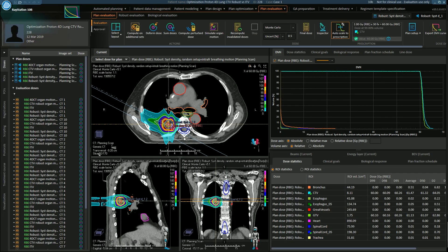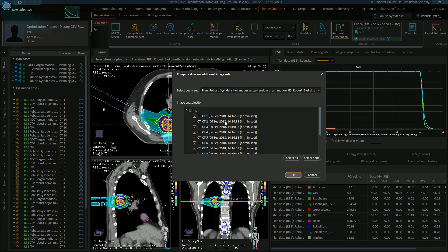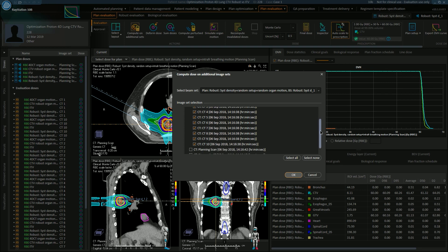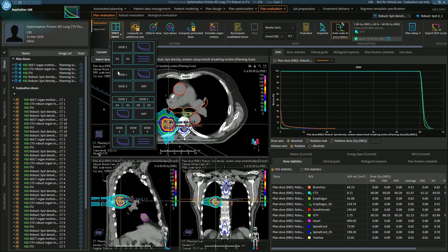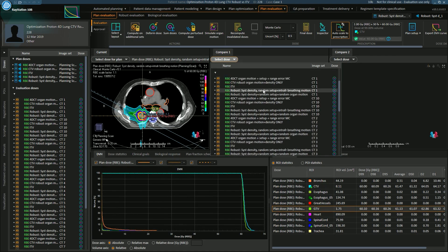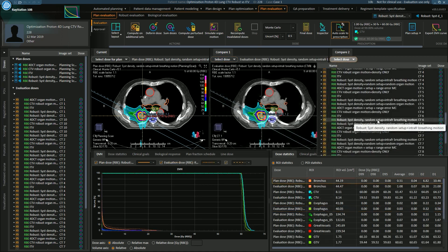They will be used in the robust optimization and a plan will be created on the nominal scan. We need to evaluate the plan to assess whether it is robust on every phase of the breathing cycle. We can do this in plan evaluation by using the compute on additional datasets. I can select my plan and recalculate it on every single phase of the breathing cycle. Let's take a look at this plan on phase 1 and phase 6.